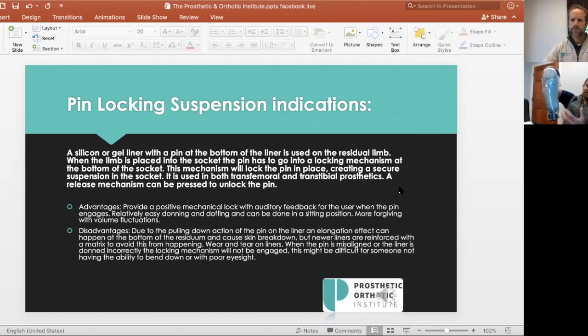Overall, throughout the day, this can be an uneasy feeling for your patients, especially the new amputees. This can also create a lot of stress, a lot of residual limb issues that could occur as a result of this pistoning effect. The other aspect that happens here is that the residual limb is going through this hydrostatic unloading feature. So what do I mean by that? You're putting weight through the prosthesis, and you're walking and lifting up the prosthesis.